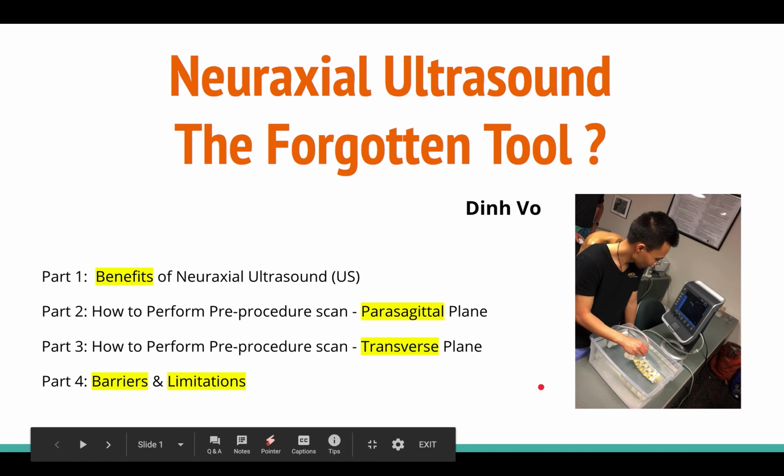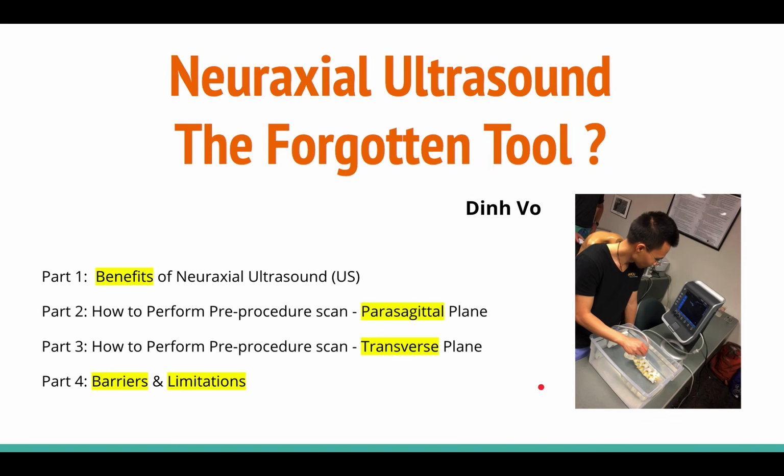Hello and welcome to my video lecture on the topic of neuraxial ultrasound. In the talk, I will focus specifically on how to do a brief procedural ultrasound scan before spinal epidural placement.